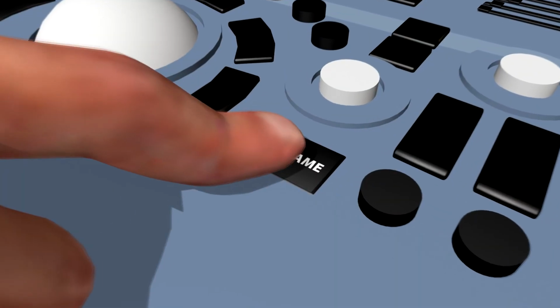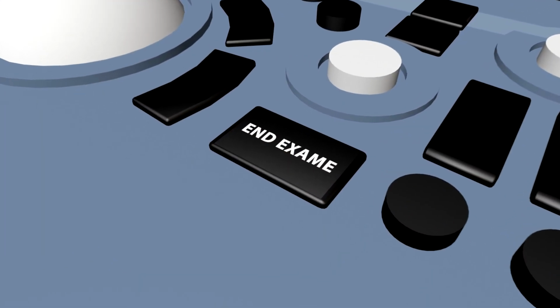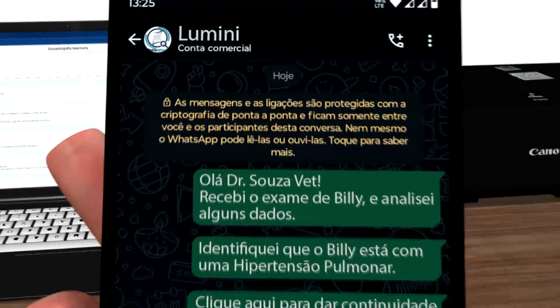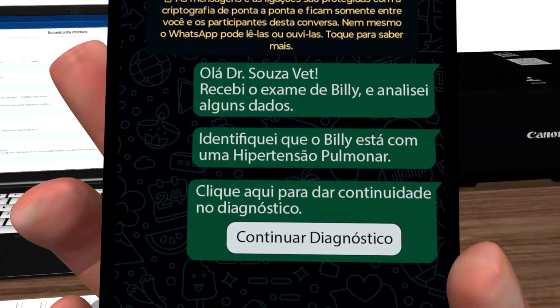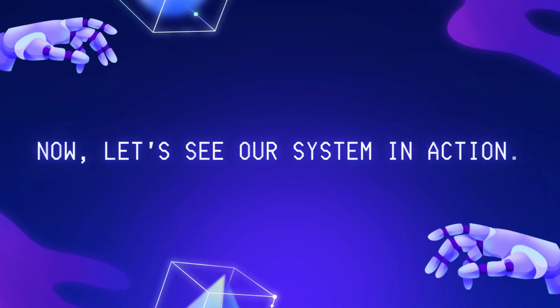Now, imagine another scenario. After pressing the End Exam button on your device, if any abnormality is detected in the exam, Lumini will inform you about this finding and ask if you wish to proceed with the diagnosis. Now let's see our system in action.